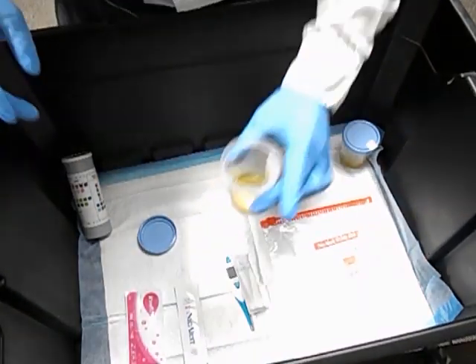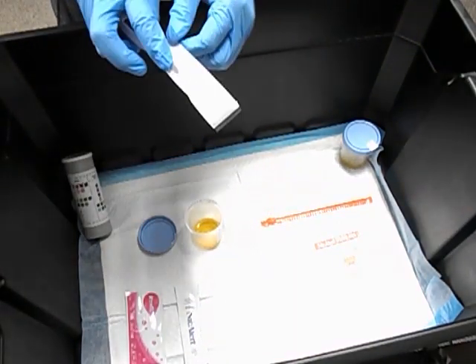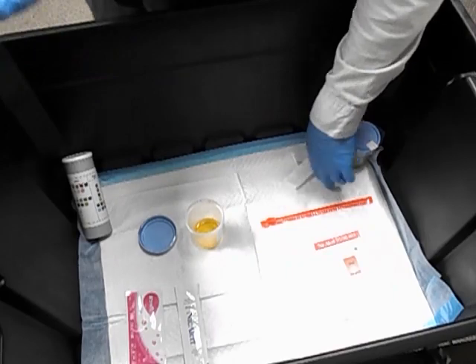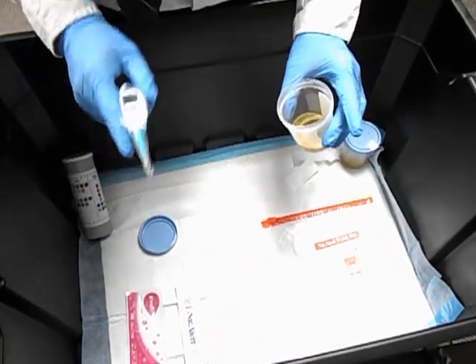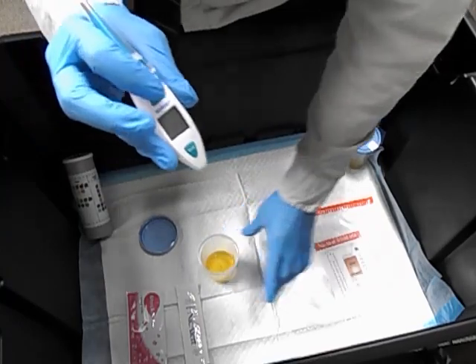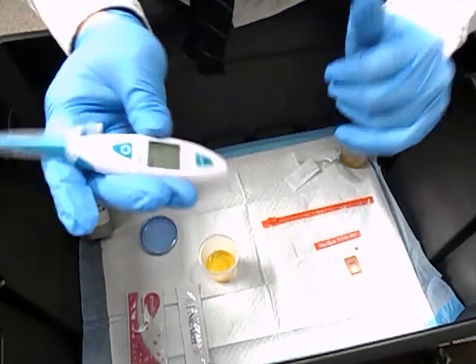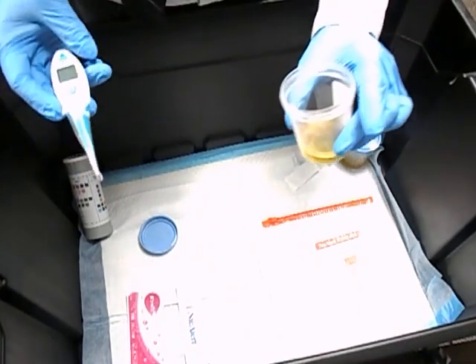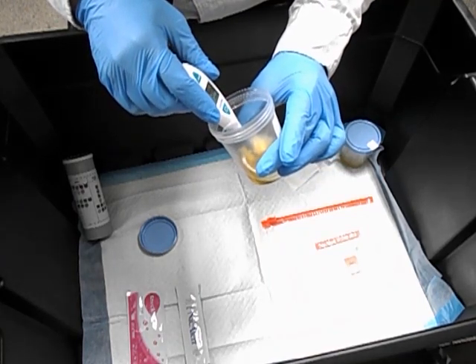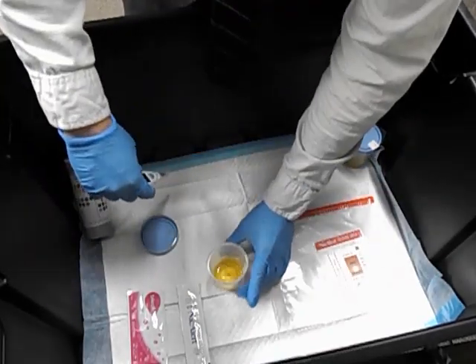The first thing you want to do is take the temperature, since the longer you wait, the colder it will get. If it falls under 95 degrees you'll have to ask the patient to provide a new sample. When you turn on the thermometer, make sure the hourglass on the top right disappears before dipping it into the urine — it won't work until it finishes loading. Dip it in for a couple of seconds, wait for the beep. This reading is 96.6, which is in the acceptable range, so we can move on.